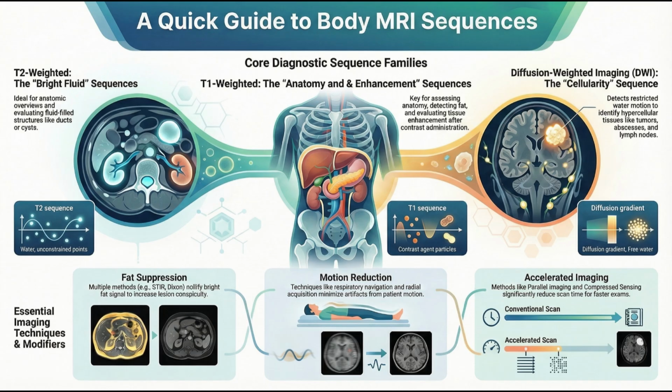So if you need T2 fat sat after contrast, you have to use the spectral method, SPAIR. Precisely. Spectral attenuation inversion recovery. It uses a fat-selective pulse that targets the specific frequency of fat, not its T1. That means it has a higher SNR than STIR, and crucially, you can use it after contrast without any fear of suppressing what you want to see.